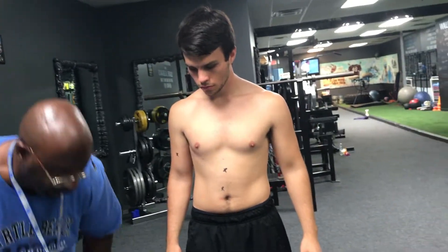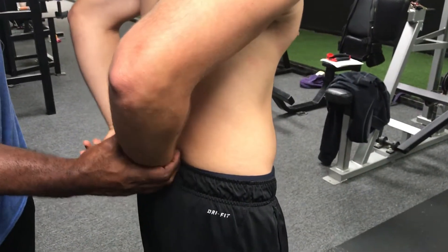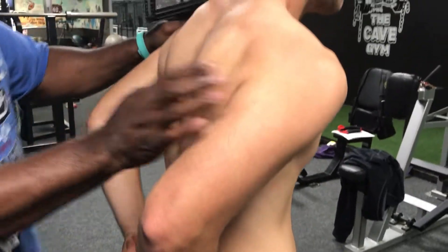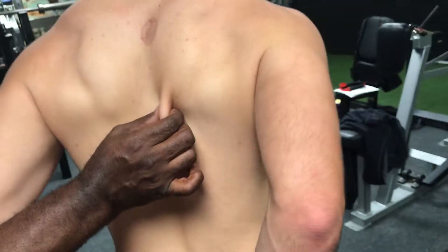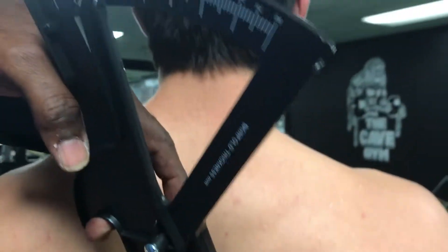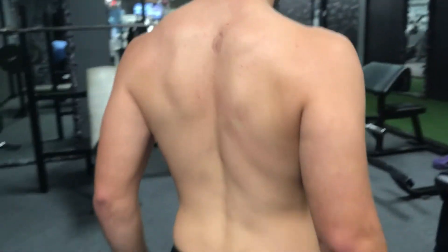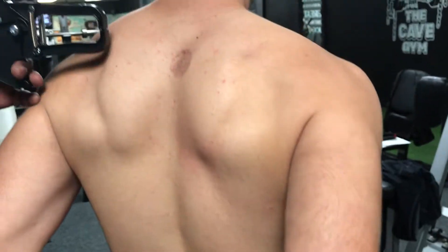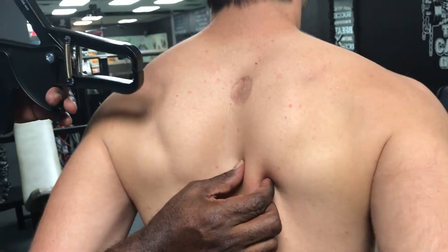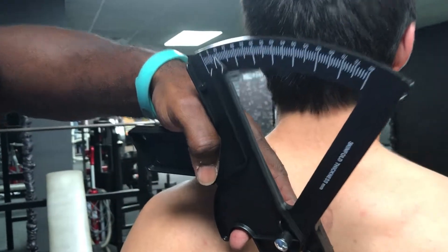Next is the subscapular — that's your back. Go ahead and turn around and put your arm behind your back right here — that'll flex your shoulder blade. Turn just a little bit more. Go ahead and put your arm down. That's 10. Put your arm back again — and that's 9.